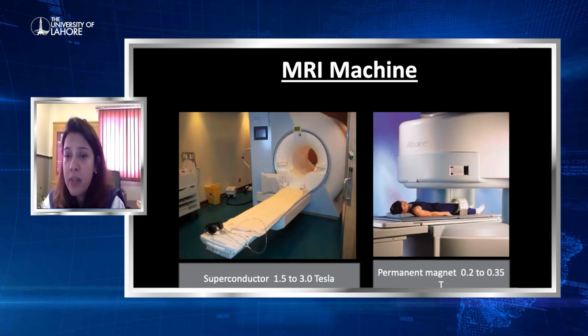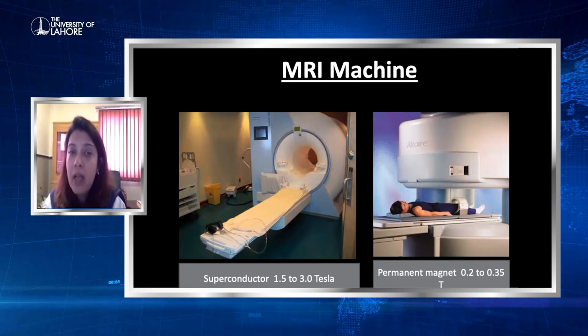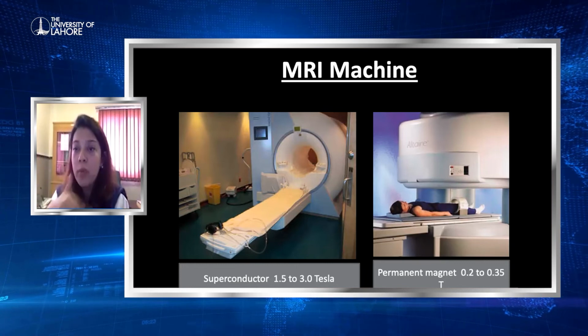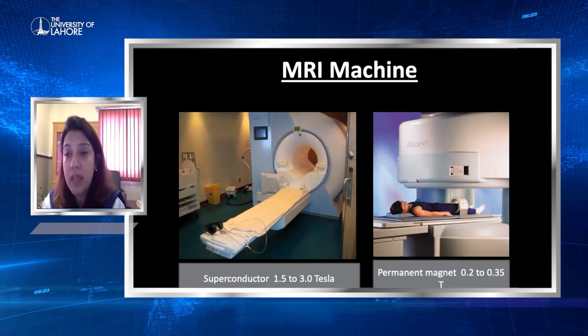You can also get images on this open MRI. The main thing is that people are claustrophobic about going into this machine. Now, the lumen or the bore is very wide, quite wide, so it's not a problem. But still, if somebody's claustrophobic, they can do it under sedation.